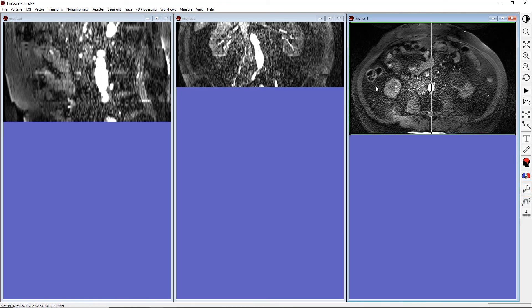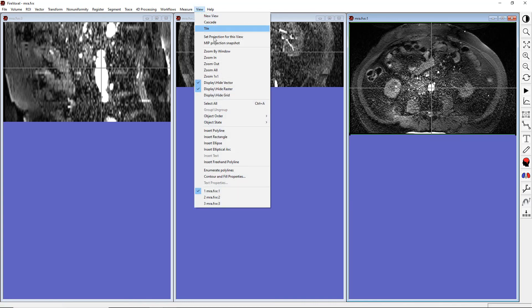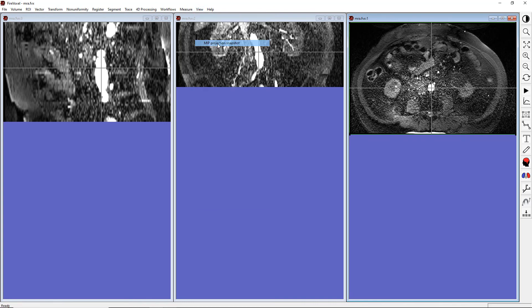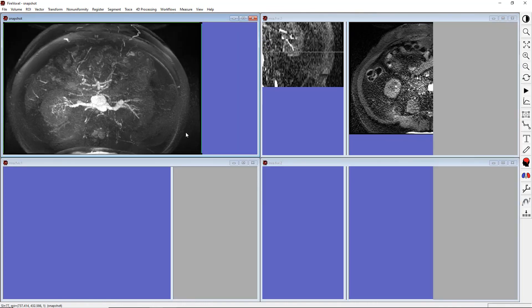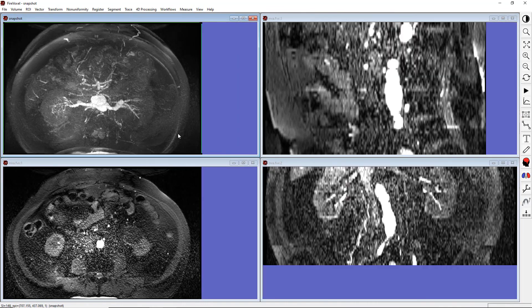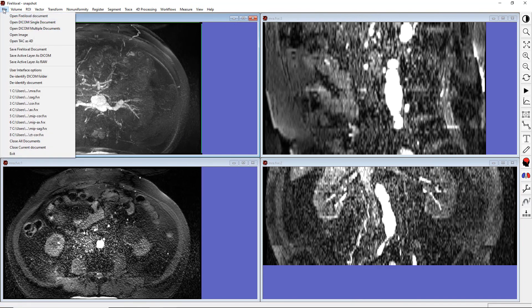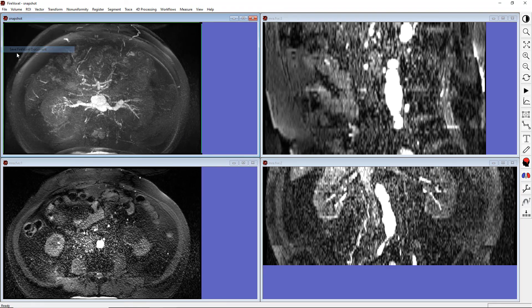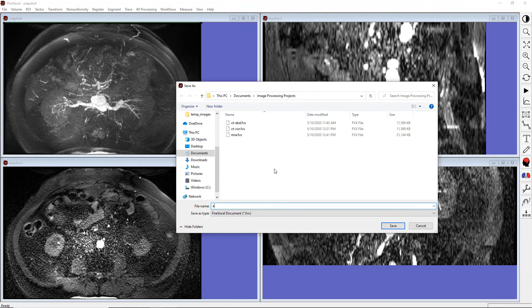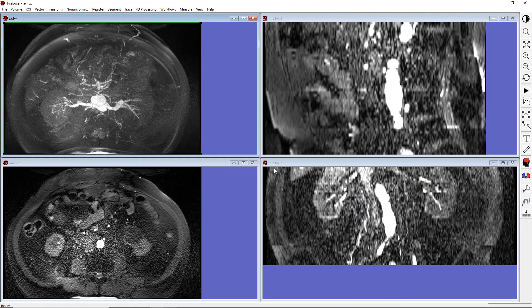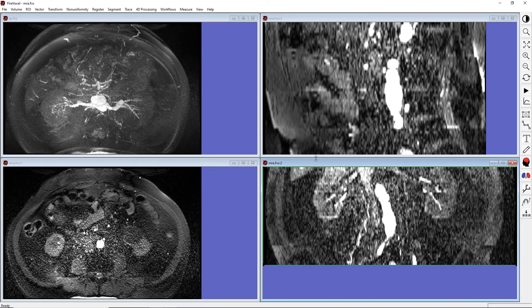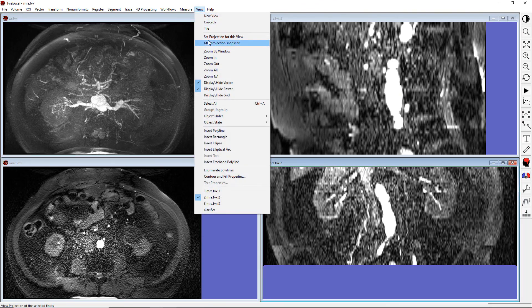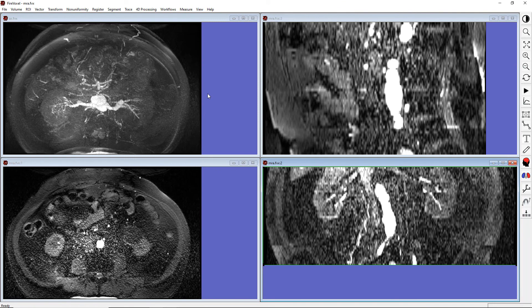Let's click on the original axial view, and select View Maximum Intensity Projection Snapshot. And now we have here the axial maximum intensity projection. Let's save this view. Let's now do the same for the coronal view.